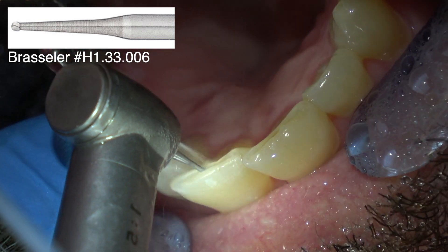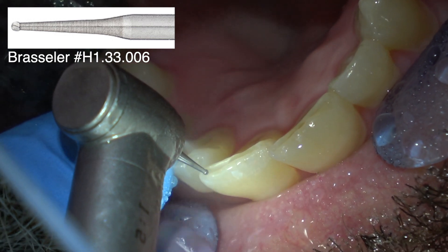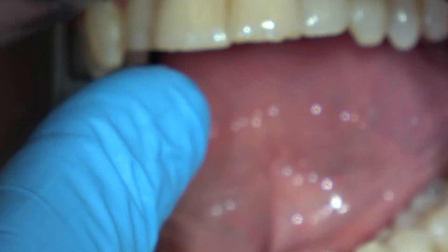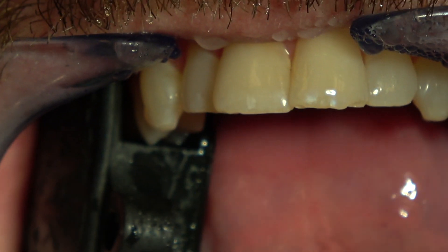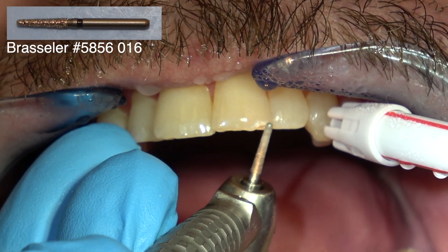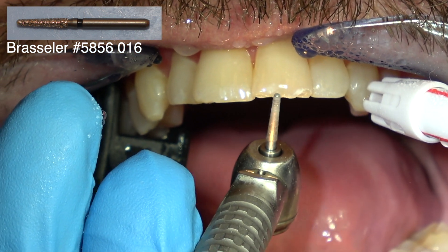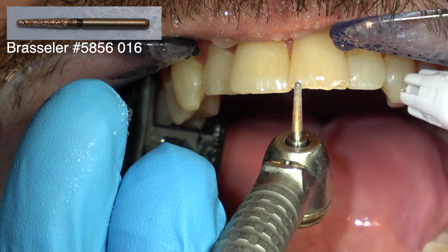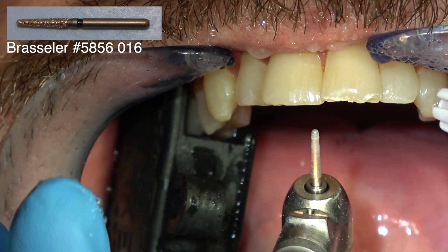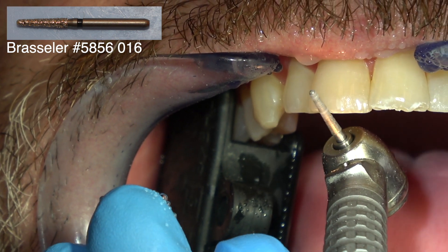Very few people wear their teeth like this during the day — it occurs at night when they're sleeping with that unconscious bruxism teeth grinding. So you can see that's just a tiny little movement. Now we've also got this little bit right here that we want to improve. I'm just barely going to freshen the surface of that edge — just so you've got a fresh surface. It's like gluing two boards together: you want the surface to be fresh, not dirty.